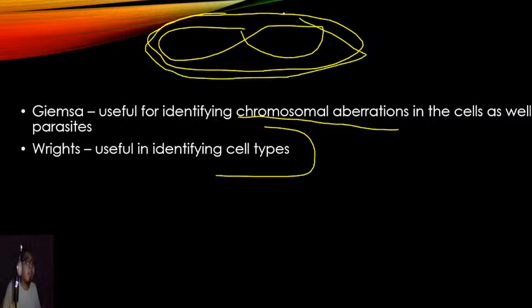We're going to talk about it next time we see each other. But I just want you guys to have a little bit of a review. Figure of 8. What do you call a figure of 8 in the RBC morphology? Come on. What do you call the figure of 8 abnormality? It's made up of filaments or chromosomal filaments.